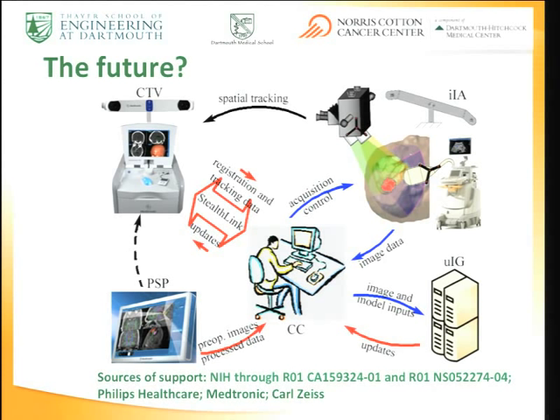We've got some trials designed to see if that's going to produce any kind of a surgical outcome. We're only looking at surgical outcomes, completeness of resection types of measures based on post-op MR assessments, that we hope we're going to get to over the next handful of years. So we're excited to work with Medtronic on this project. It's been a long time in coming. We've been developing a lot of these ideas since the mid-90s, back to the MIGA days. And hopefully we'll get this out now on a platform that maybe others could try as well.